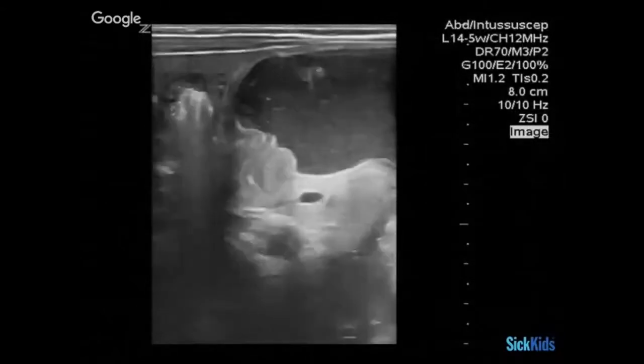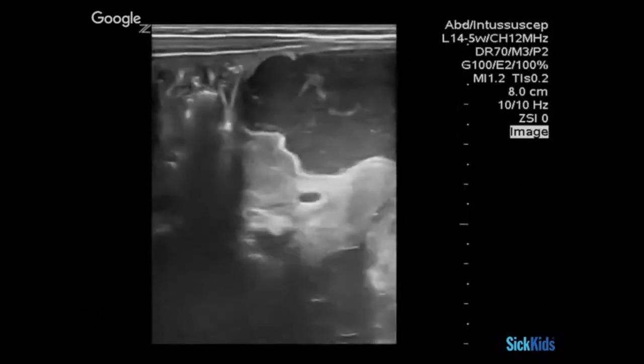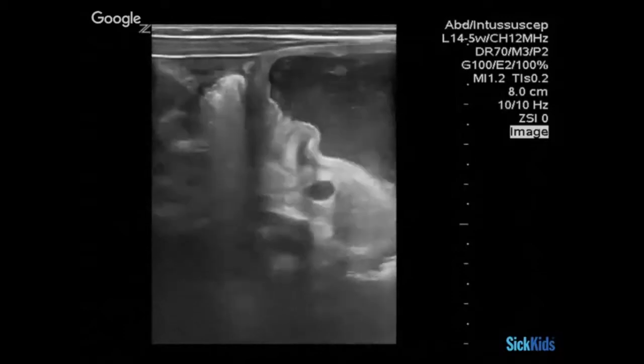Here's a nice sign that gives away pyloric stenosis — does anybody know the name of this sign? This is called the nipple sign, because you actually see the muscle pushing back into the stomach. It's a giveaway that the muscle is definitely enlarged and obstructing. You see it kind of pushing back into the stomach.